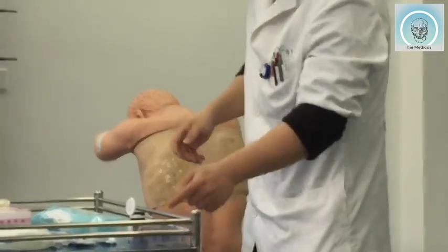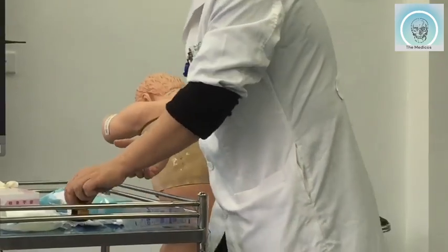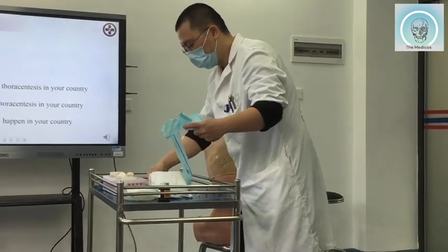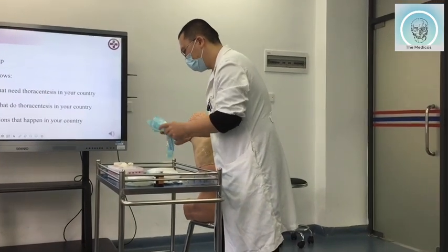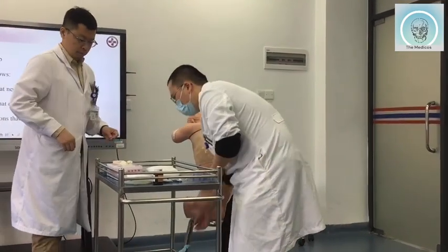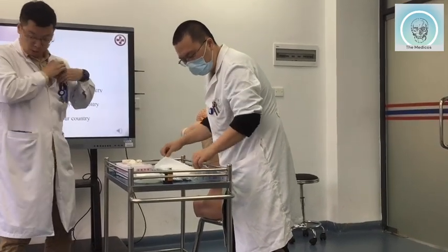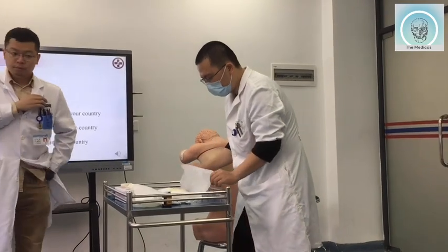Every time you touch the patient, you can put the little package and the chart on. You see the sterile bag here.